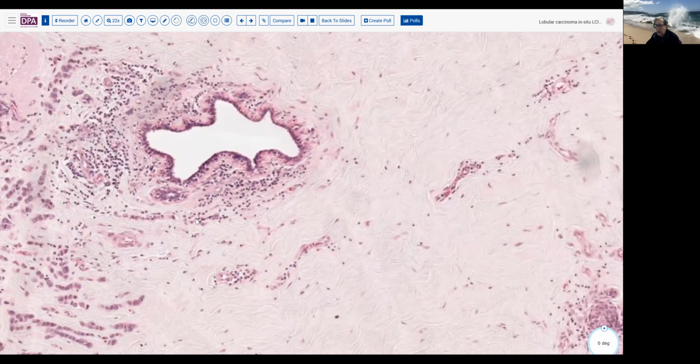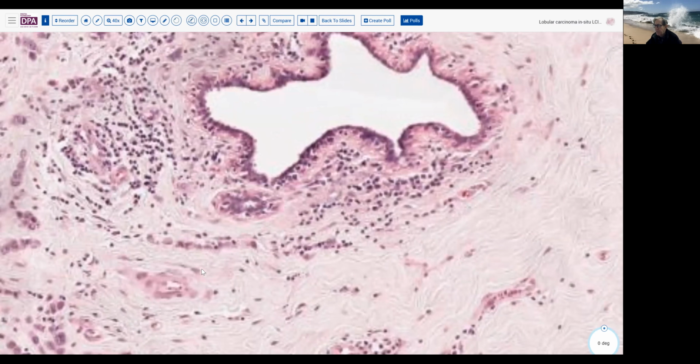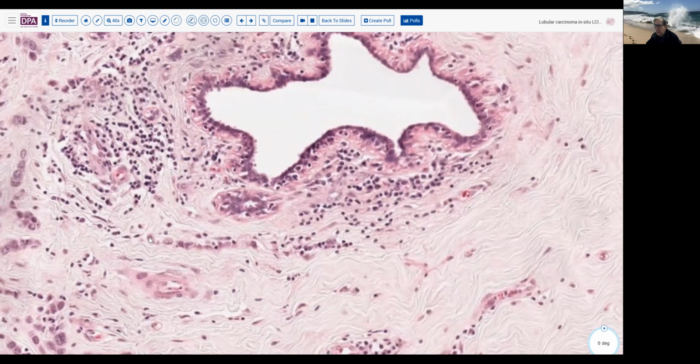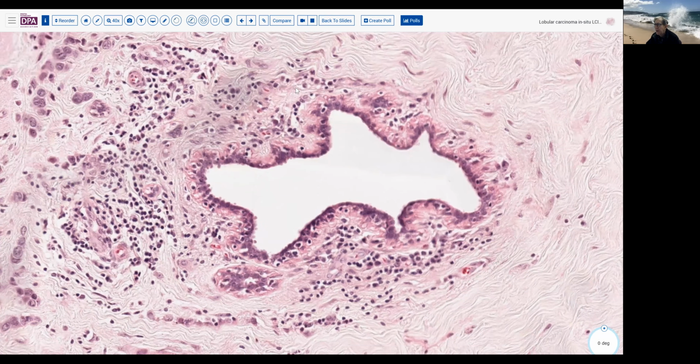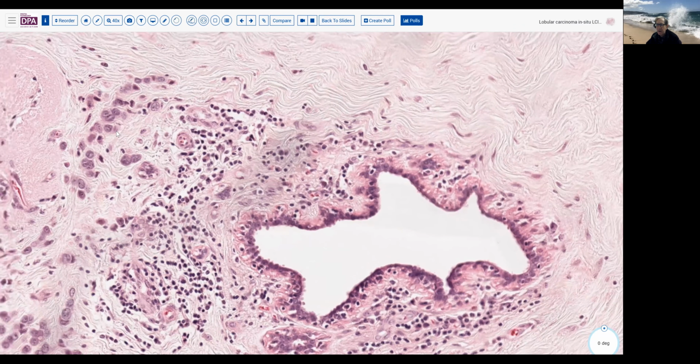Yes, some of these are inflammatory cells, but in this mix you also have these atypical tumor cells that are involved in this infiltrative process around this duct. And notice how these cells can just look like very isolated histiocytes. You can imagine how these could be mistaken in the right context for histiocytes.